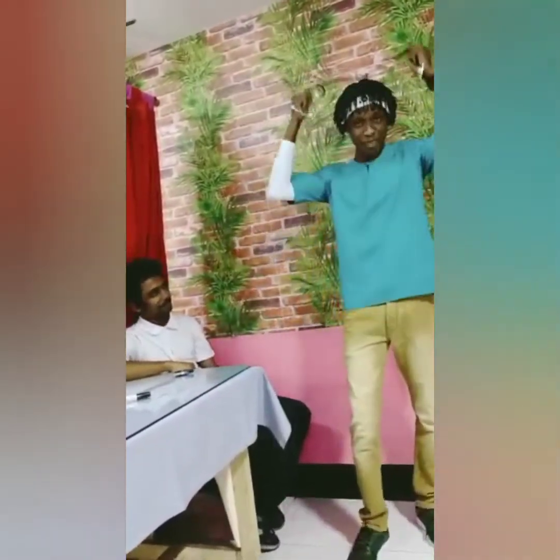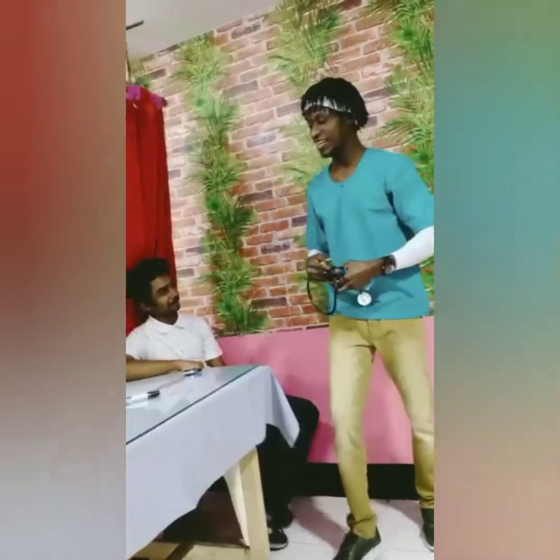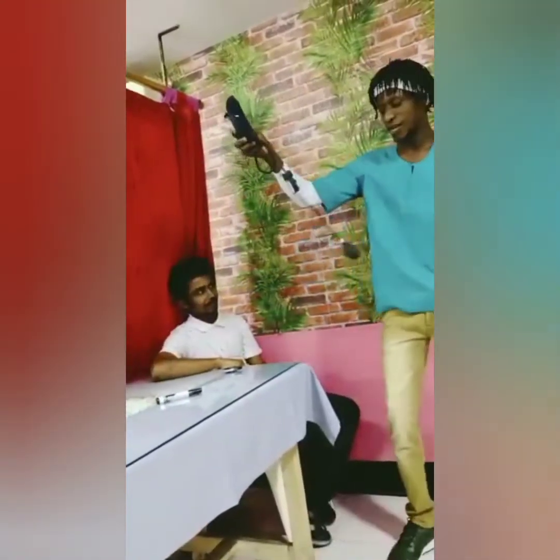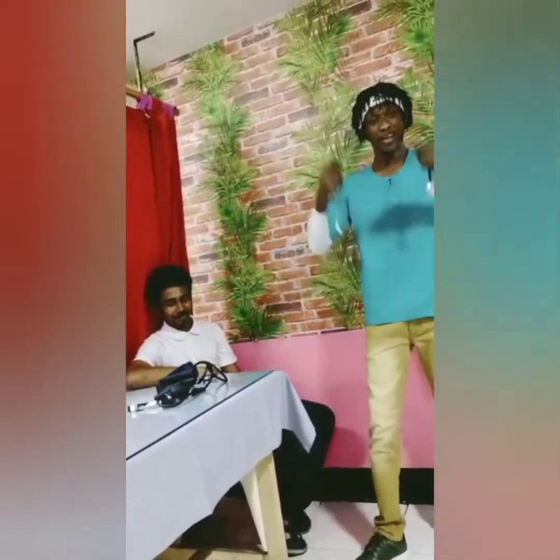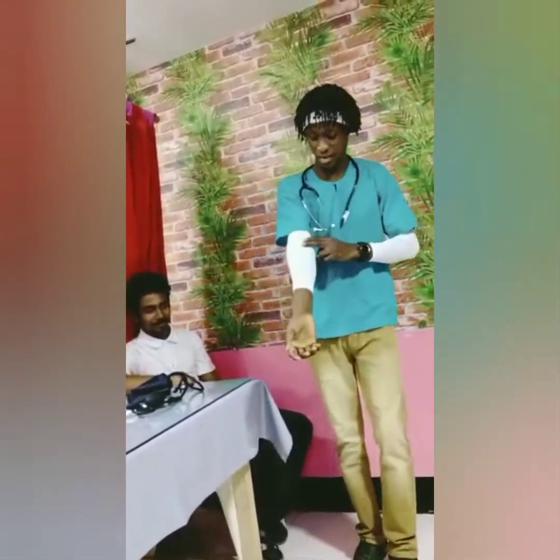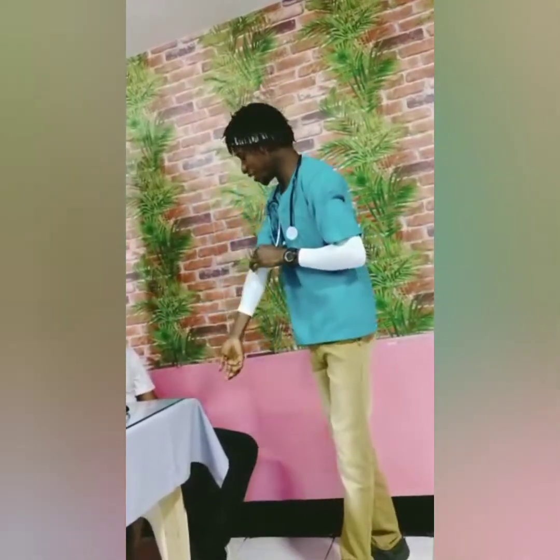So this is my stethoscope, and this is my blood pressure cuff. Where do I take my blood pressure? I take it from the brachial artery, or some people call it the upper arm. I think I can feel mine. Yeah, I can feel it. You can also try it.